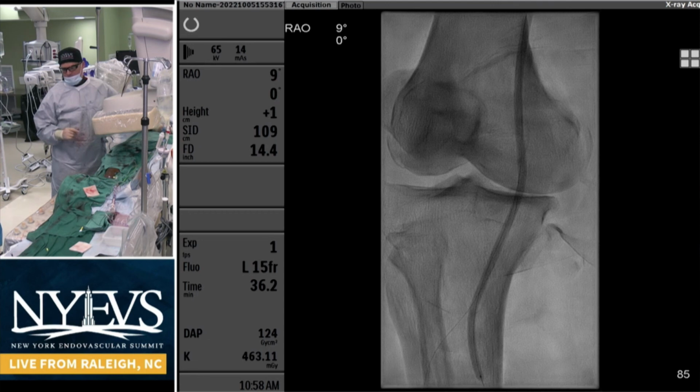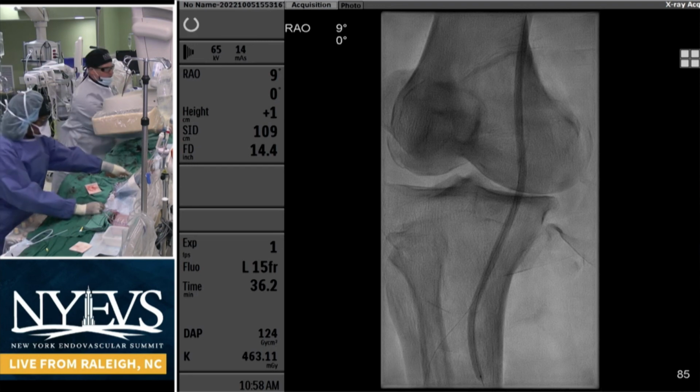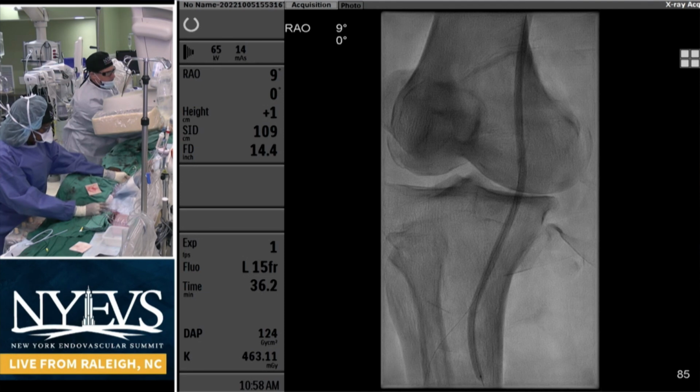Yeah, I mean, that's a very good point, because like I was saying, nowadays you have coronary stents, especially the Megatron stent, which actually you can upsize, the proximal end or one edge of the stent, to a bigger lumen and still keep your distal end or the other end of the stent to its nominal size. Yeah. So that's one of the advantages we can have in these coronary stents as well, and they expand very well.